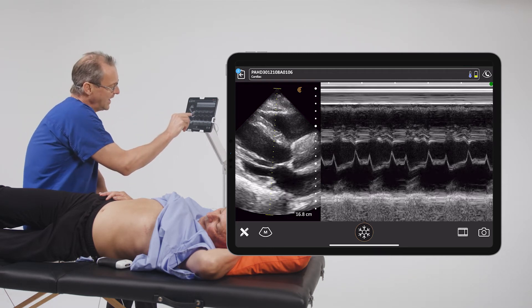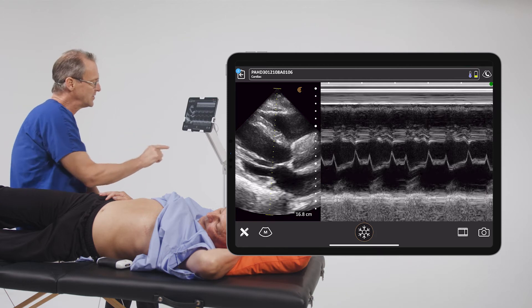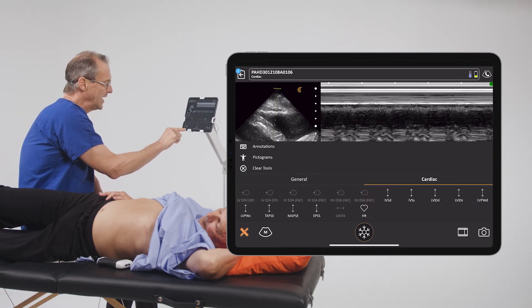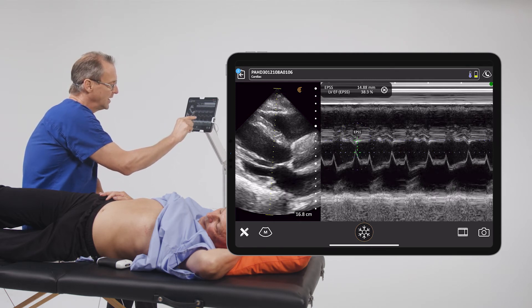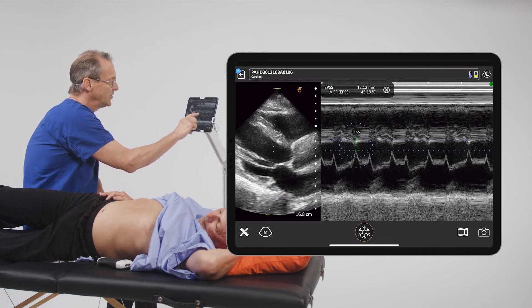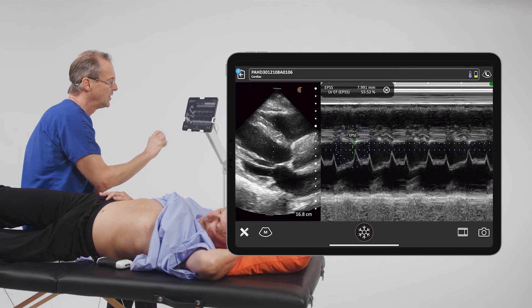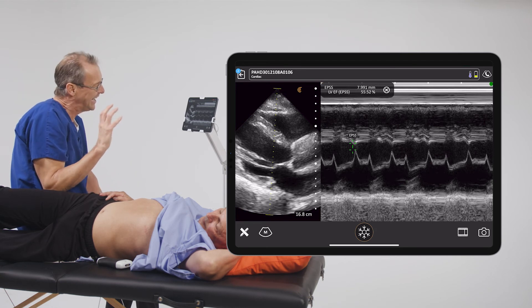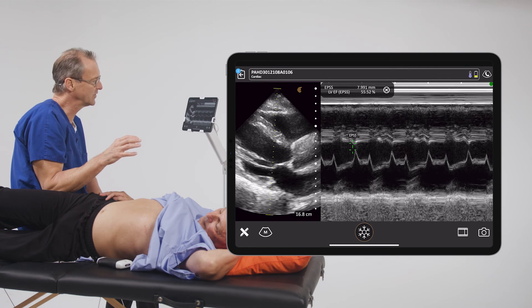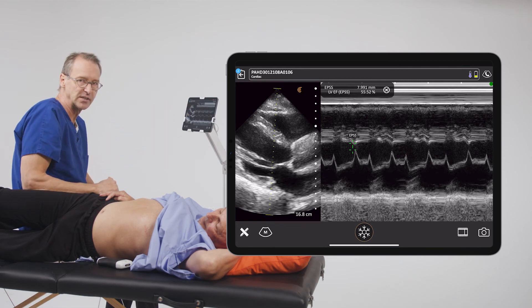E-point septal separation asks what is the distance between the E-wave and the interventricular septum during diastole. The way we measure that is to go into our measurement menu right here, tap on EPSS, establish our first line near the interventricular septum, and establish our second line near the tip of the E-wave. We move those two lines so they are precisely on the points that we want, then look at the measurement. In this particular situation, we can see that it's right around eight millimeters. Eight millimeters and less is a normal value for E-point septal separation. With Clarius, you can see that it actually estimates the ejection fraction at 55 percent.